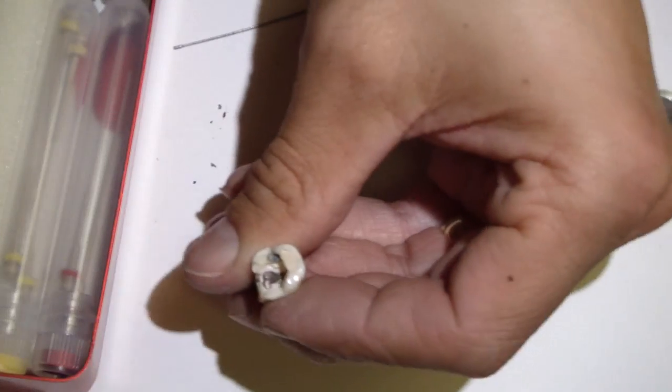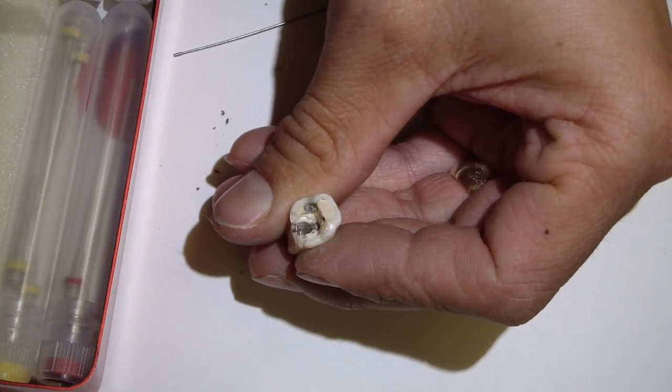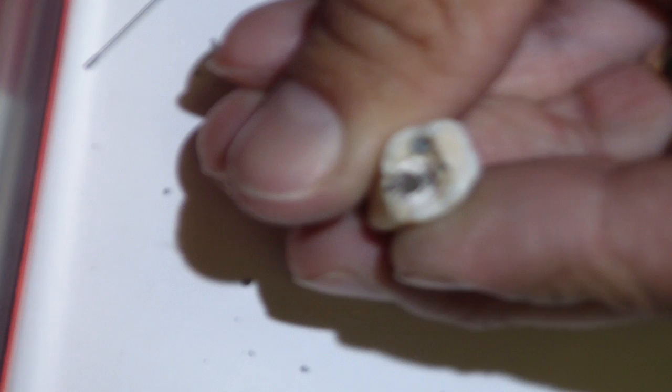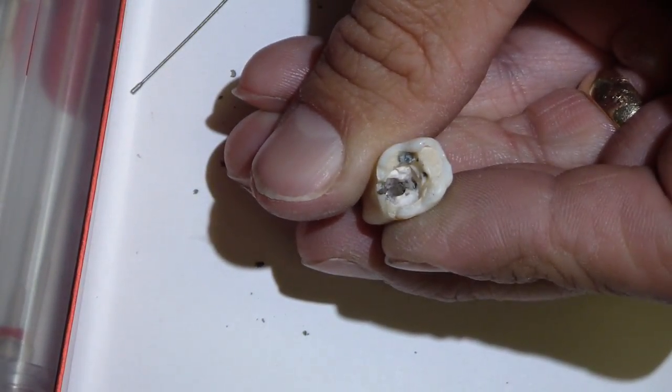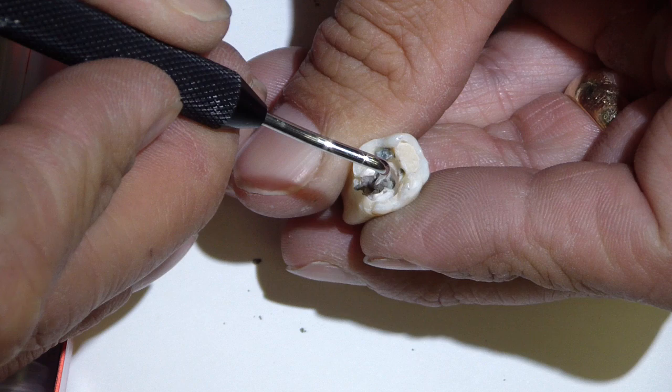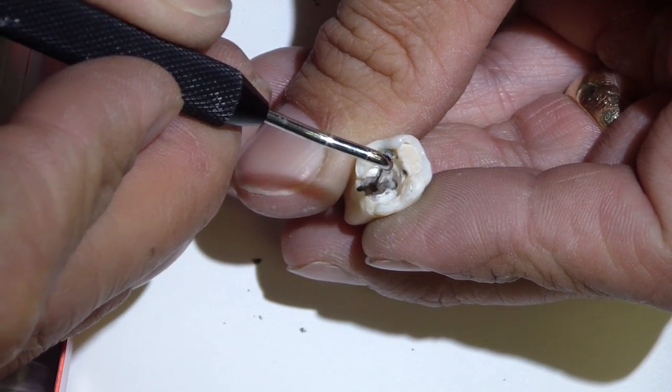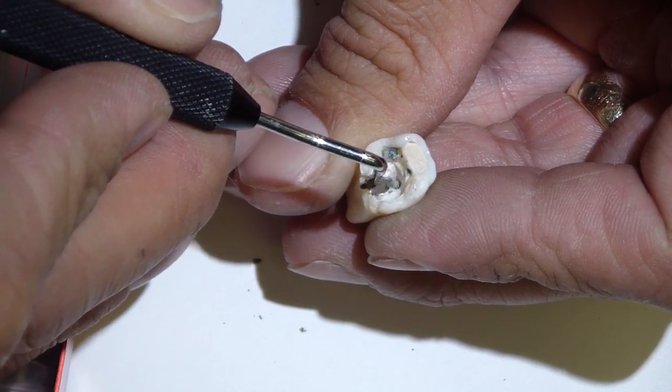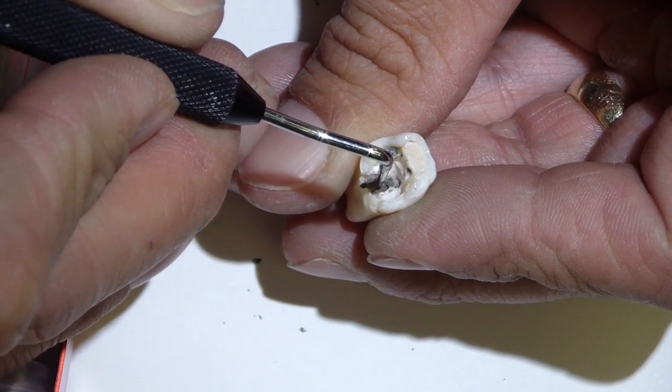We take our condensing instrument. There we go. And then condense apically. You may need to fill this a few times. You can use ultrasonics if you have, to ensure that you have a dense fill.